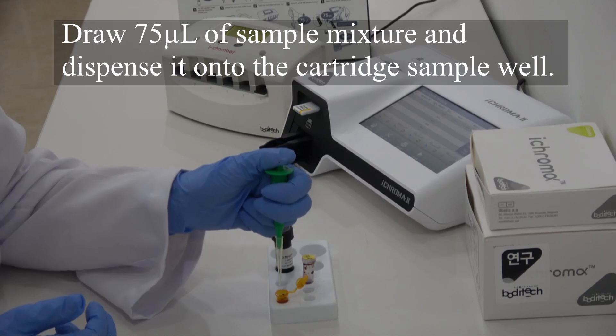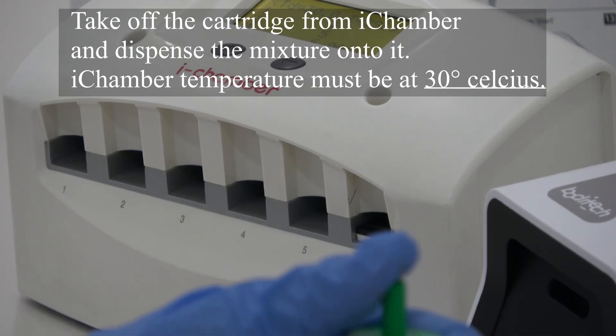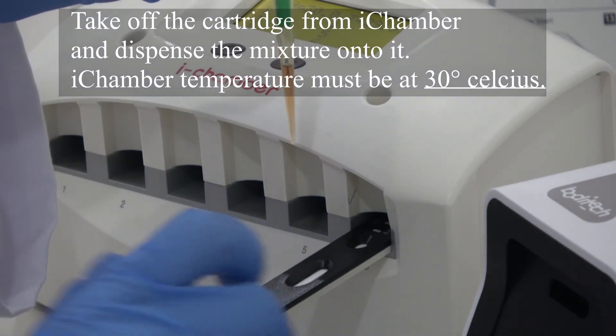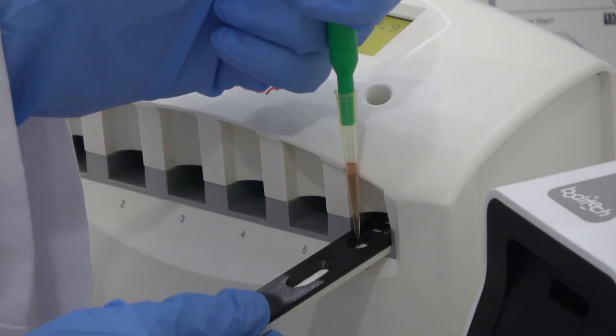Draw 75 microliters of sample mixture and dispense it onto the cartridge sample well. Take off the cartridge from iChamber and dispense the mixture onto it. Do not forget, the iChamber temperature must be set at 30 degrees Celsius.